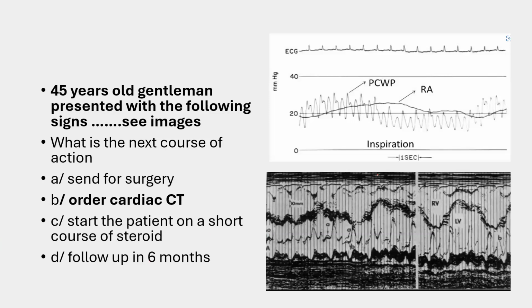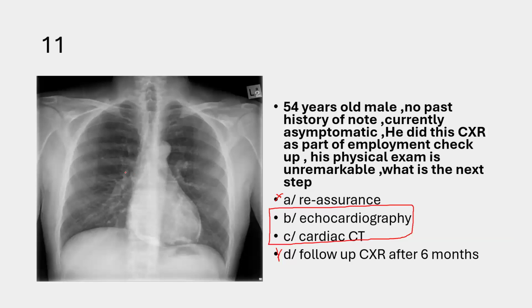Okay, look at the previous patient. That patient was having a clinical sign of constriction, and we did echo and found septal bounce. So probably we have confirmed constriction. Then we have to go for cardiac CT. But based on calcification alone, you don't go to cardiac CT. Maybe you go to cardiac CT, yes, it's not a wrong answer, but hierarchically, you go for echo first. Cardiac CT is going to show me the extent of pericardial calcification better than chest X-ray.